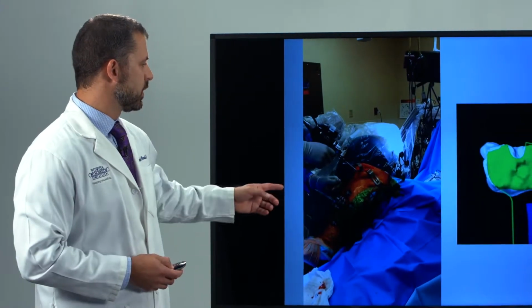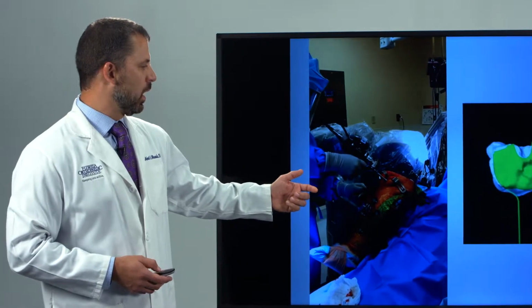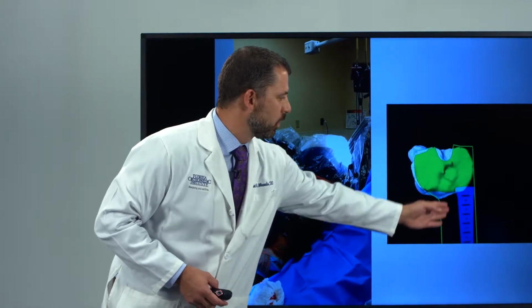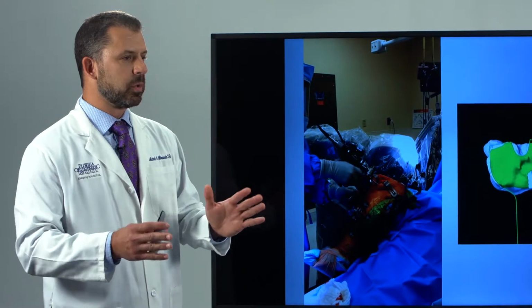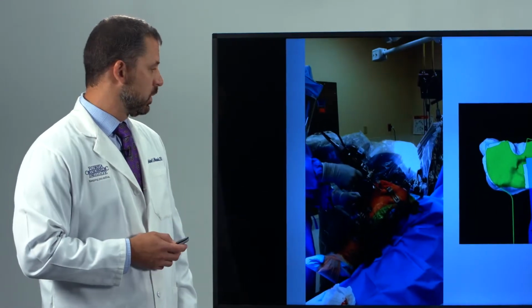That's the femur, this is the tibia. The saw blade goes into position, you hit the button again, and you'll see this blue here is representative of the saw blade, and it won't go too far to the right or too far to the left. It keeps you really controlled and precise into that position where the bone needs to be removed.